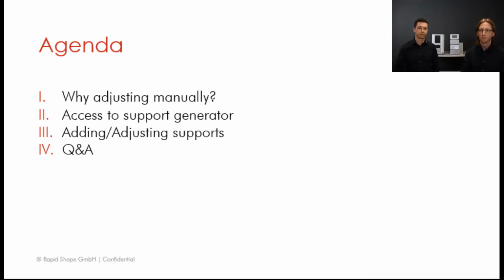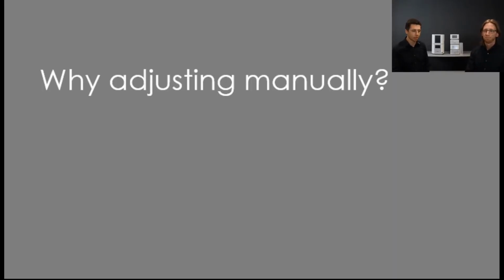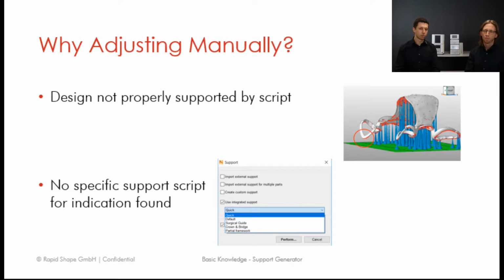All right, so I think we can just start right away with why we have to adjust this manually. Okay, so as Robert said, first question most likely is, why do I have to adjust? So mainly there are two reasons for this. First of all, your design is not properly supported by the script. We already mentioned most of the designs should fit to our support script, but there are some which won't be supported properly. That's why it's important to check your part you're using and the support script afterwards if it's really supported properly.